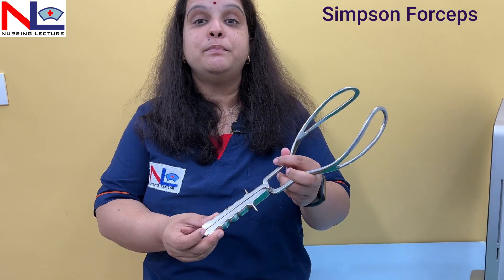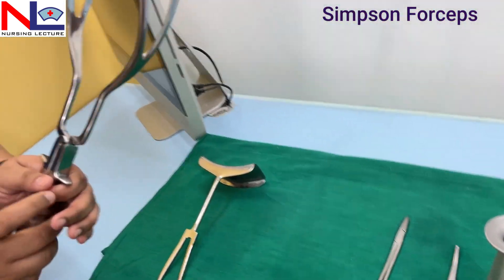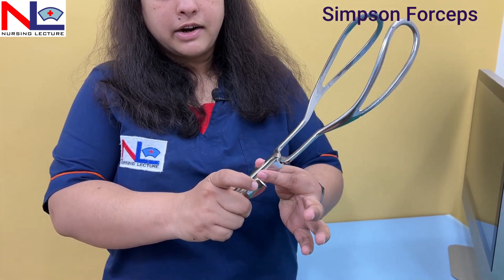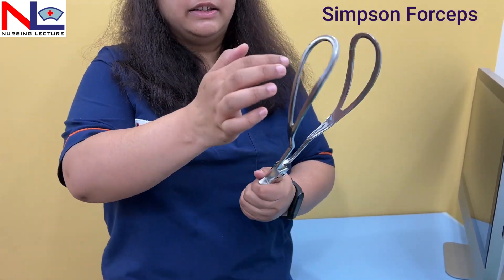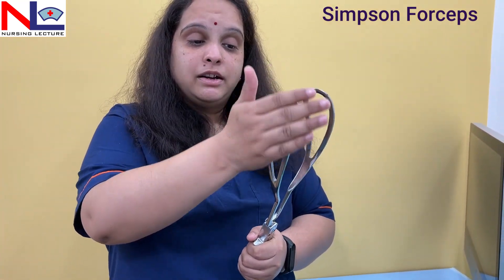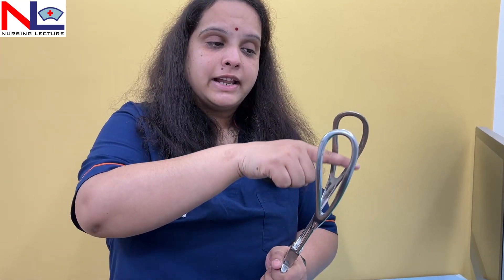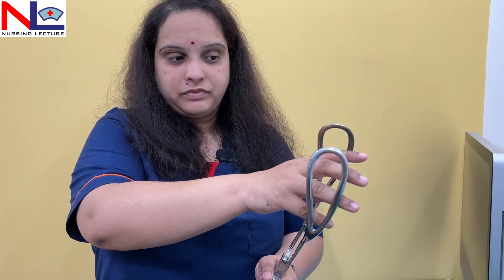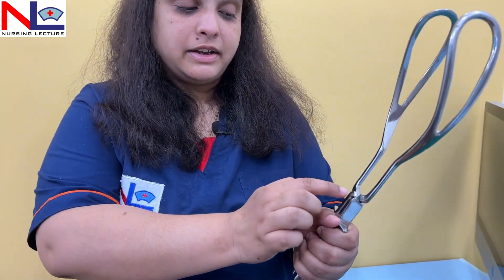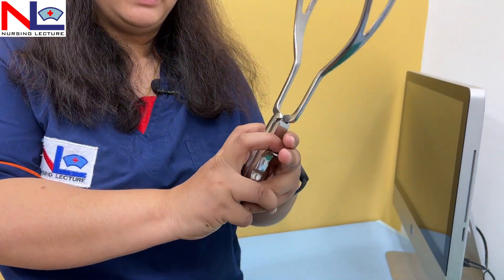Next is the Simpson forceps, which is used to deliver the fetus during labor. The Simpson forceps has the following parts: the blade, the shank, the lock, finger guard, and the handle. In the blade there are large fenestrations, and these fenestrations allow the fetal head to be grasped properly — fenestrations help in better gripping. The part of the blade in relation to the mother's wall is the pelvic curve, and the part in relation to the fetal head is the cephalic curve, where the fetal head gets fixed.